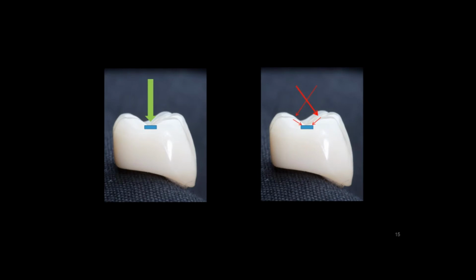And that's what I'm trying to get after here: I don't need teeth that are locked together, because they're built to have hit and slide. Okay? So I want you to keep this in mind. When you set 20-degree teeth, you're setting them to have working and balancing contact. So as the right side comes up and goes working, the left side has to do balance. The principle is that everything's touching and functioning at the same time on an articulator.